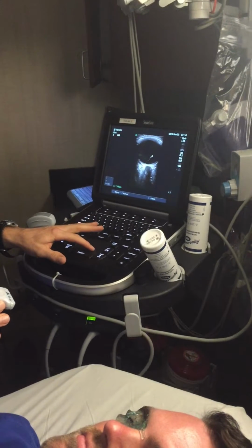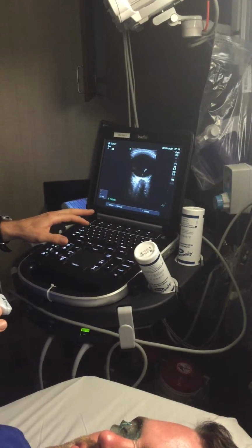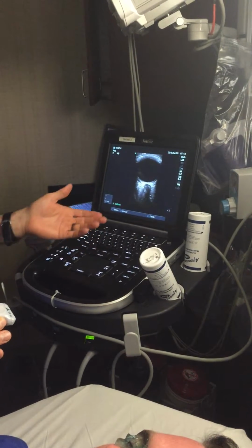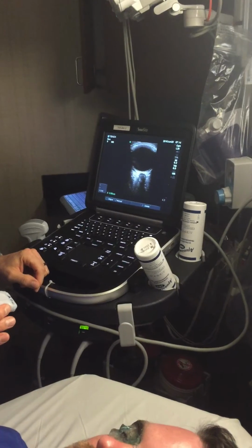You typically measure about 3 millimeters back, and it shouldn't be more than 5.5 millimeters wide. You can measure this. And his actually is showing as wide, but it's not square on. So you take 2 or 3 measurements and average them off. That's it.